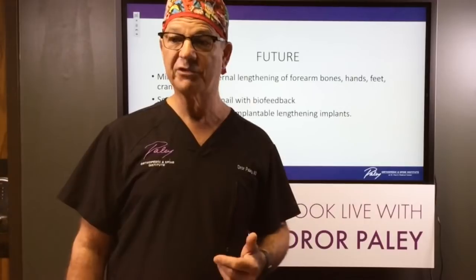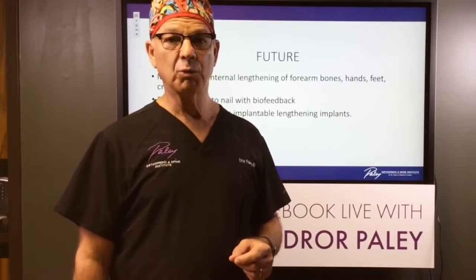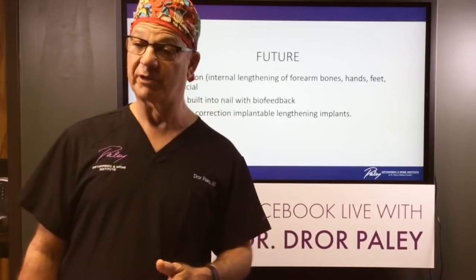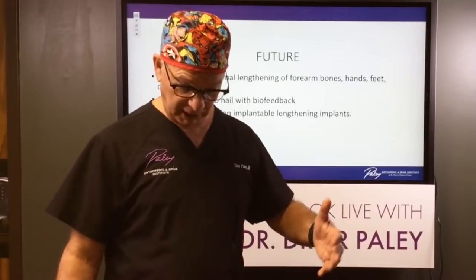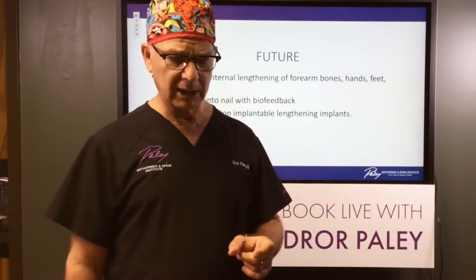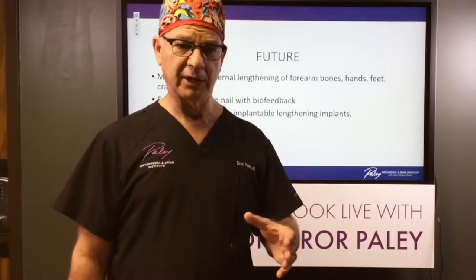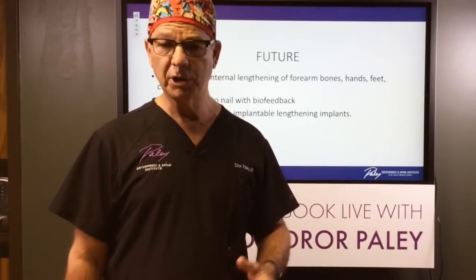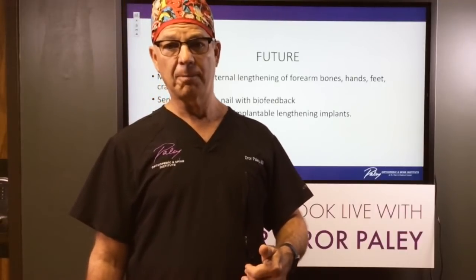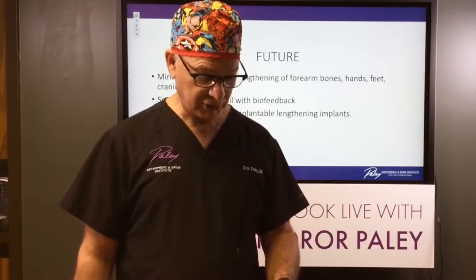So pins that go from the outside to the inside, they cause a reaction of the fat that's under the skin, and the fat gets absorbed. So then the scar tissue develops along the pin all the way from the skin to the bone. When you take the pin out, you still have that tract of scar tissue, and where the fat was, you have an indentation or a dimple. So these are characteristic pin scars. You may have seen some on the slides. You don't get that with the internal devices. So even though you have maybe bigger incisions with the internal devices, you don't get these uglier scars. And so the internal is probably more cosmetic, more aesthetic than the external.